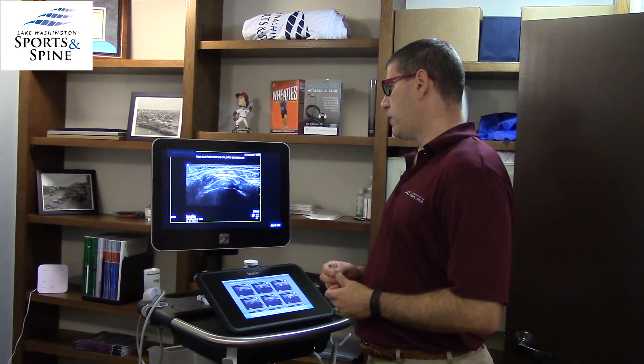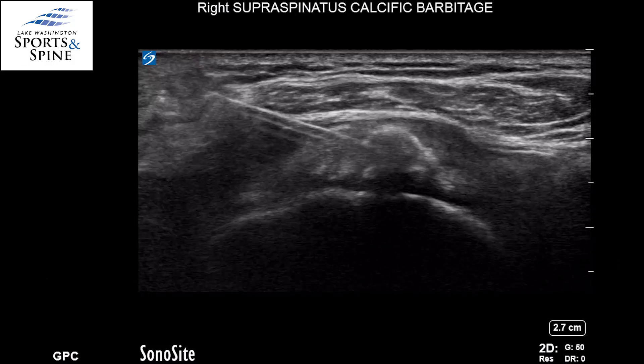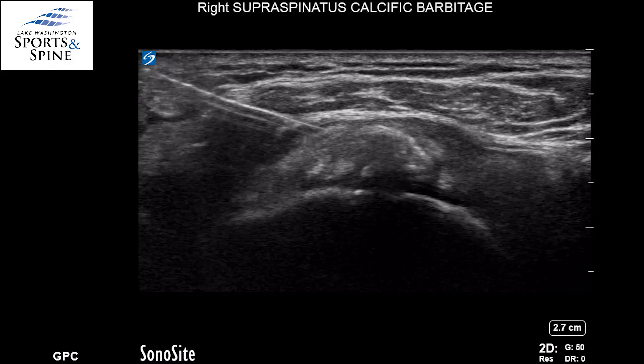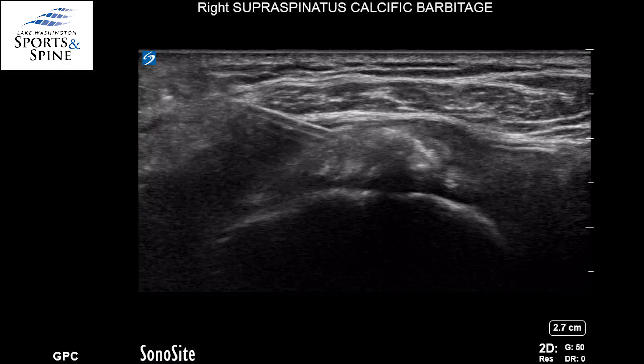On this next picture, you can see a needle directed under ultrasound guidance so it penetrates into the calcium. Once it's there, that's when the magic occurs. We can see that we're pumping some fluid into the calcium deposit, and by pushing in and pulling out, I'm actually drawing that calcium out.